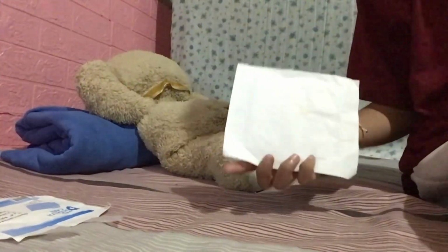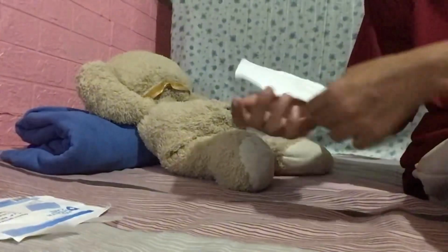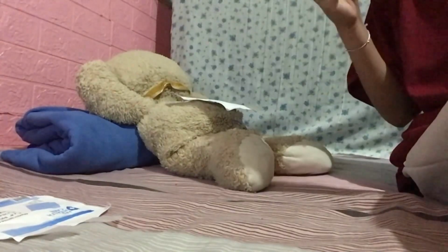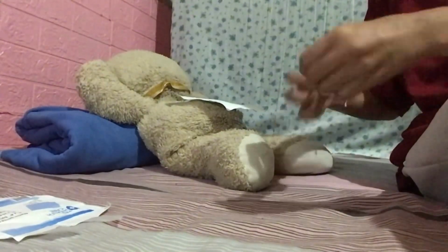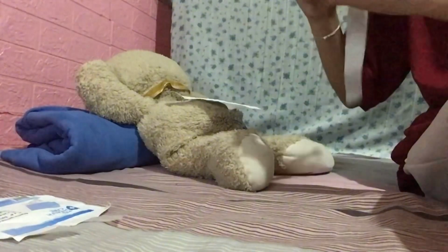And now, apply a clean, sterile dressing over the wound to protect it from further contamination. Ensure the dressing is not too tight to allow for proper circulation, and secure the dressing with medical tape or a bandage, ensuring it stays in place but does not constrict the area.